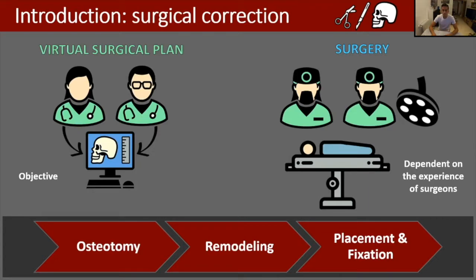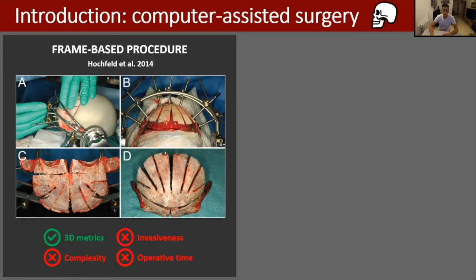This surgical correction is highly dependent on the experience of the surgeon and highly subjective. Therefore, although a pretty good virtual plan can be performed before surgery, an accurate translation of this plan into surgery is almost impossible. Therefore, multiple approaches have been proposed to improve surgical outcomes.